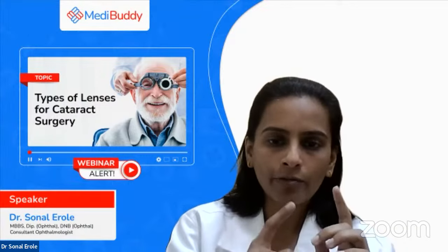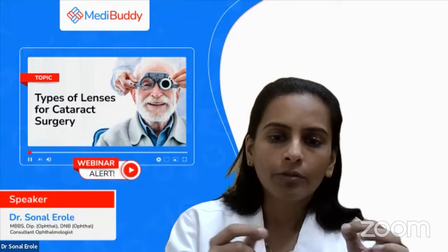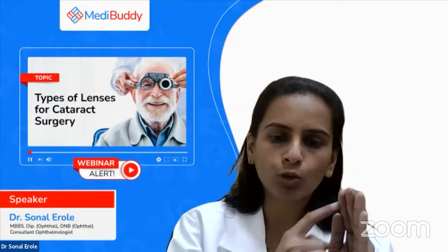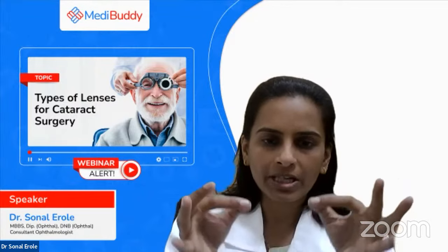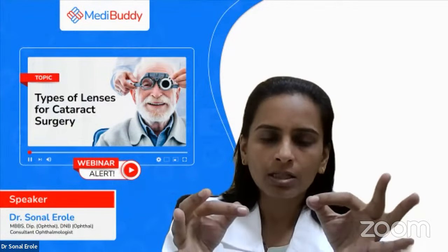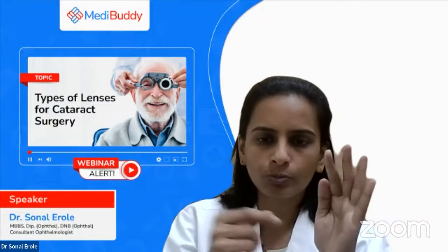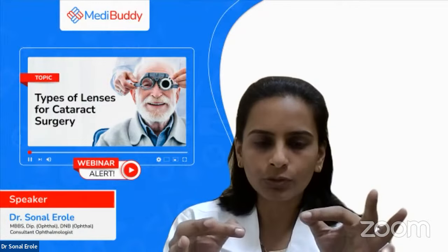We have iris claw lenses. What do iris claw lenses mean? We have a black colored iris in our eye. If we don't have good back support, we have lenses which can anchor on this iris. These are called iris claw lenses. Sometimes patients will have a history of trauma or something like this, because of which the support is not good. Then we put these iris claw lenses.